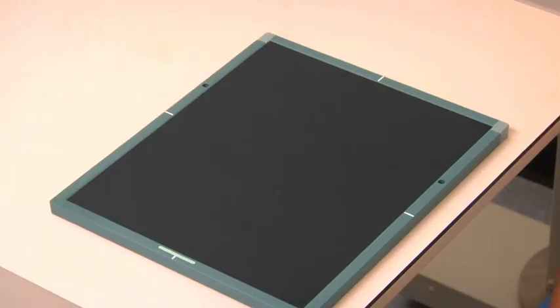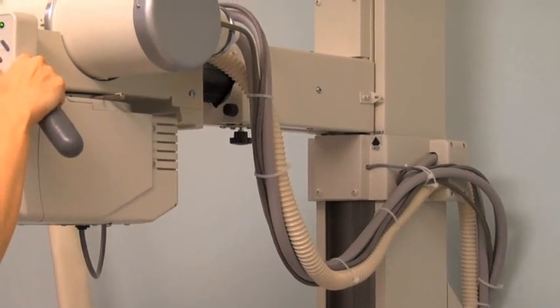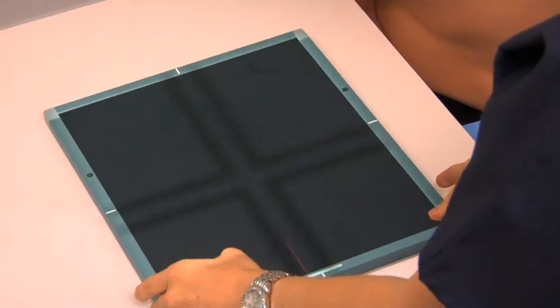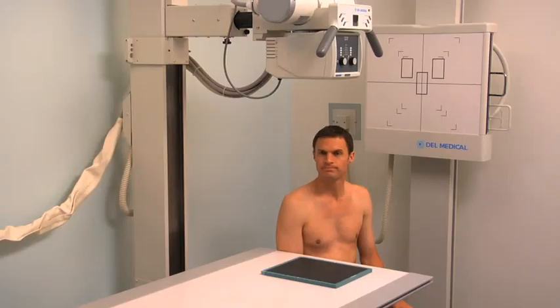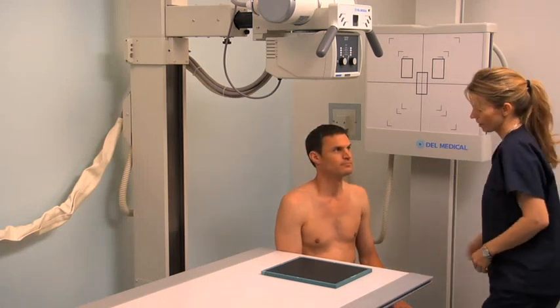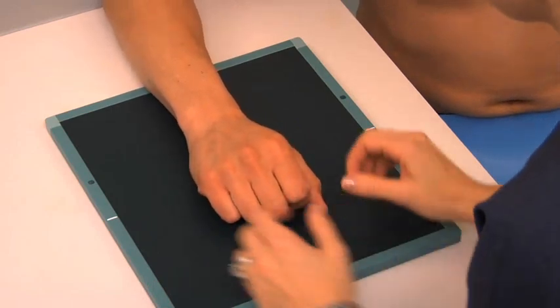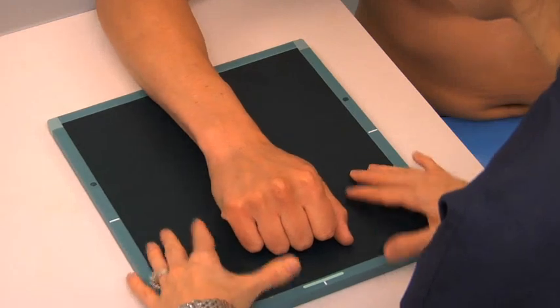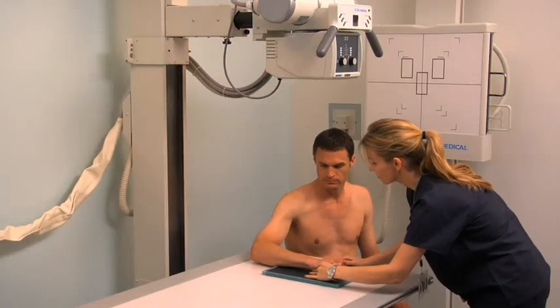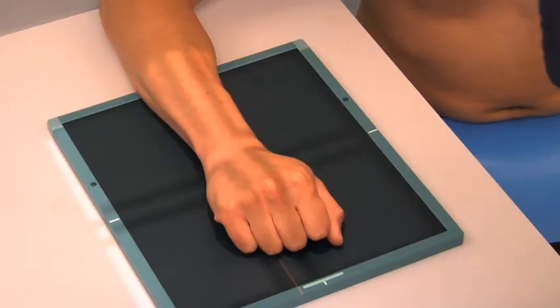To obtain a PA projection of the wrist, begin by placing an 8-by-10-inch cassette on the tabletop. Set the SID to 40 inches and align the central ray perpendicular to the cassette. Set the appropriate exposure parameters. Extend the upper limb and ask the patient to flex their elbow 90 degrees. Align their wrist with the center of the cassette. Pronate the patient's hand and place it in a loose fist position on the cassette. Palpate the ulnar styloid process to confirm that it is in profile.